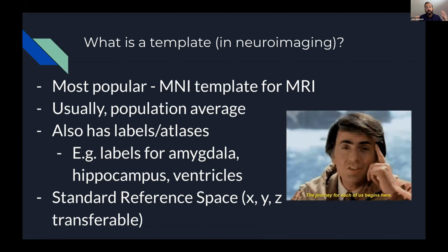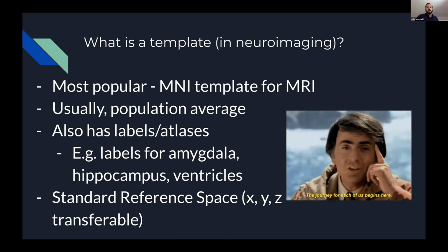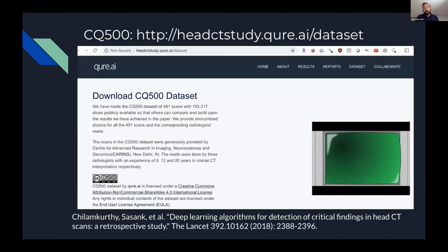Because many times, especially when we're doing any analysis, we want to say what area is affected, or what area is connected if you're talking about connectomics. But a lot of this is really built for MRI. So I wanted to do one for CT, but I needed some data out there. Again, most of the data out there in neuroimaging with respect to CT is really clinical data.